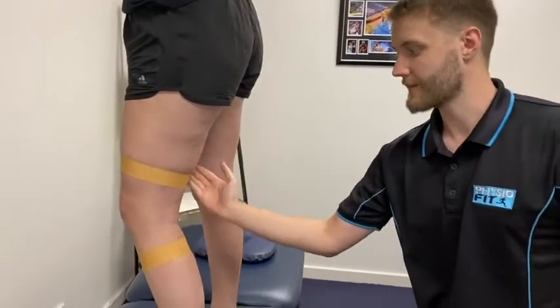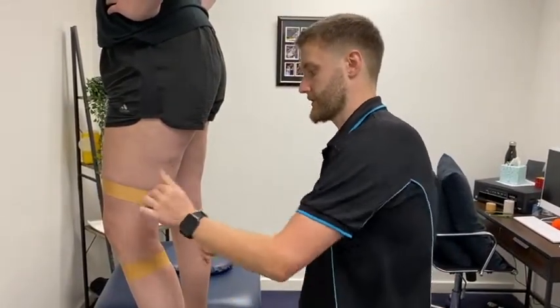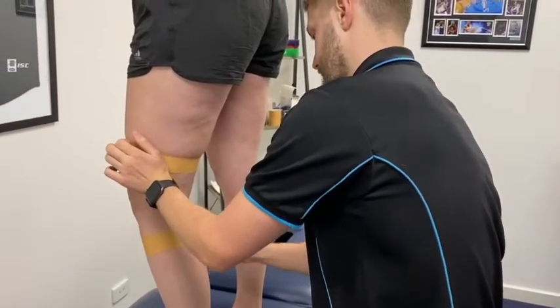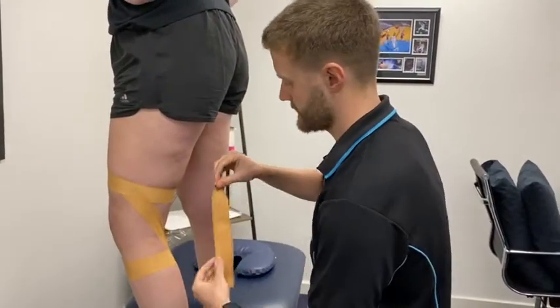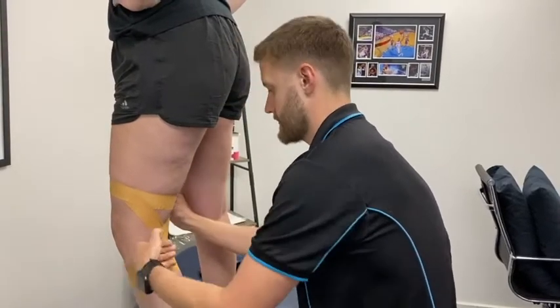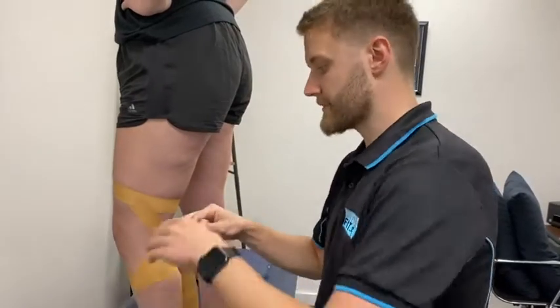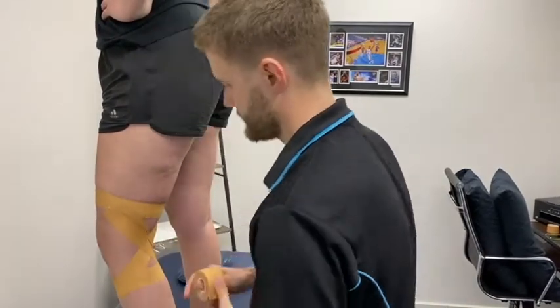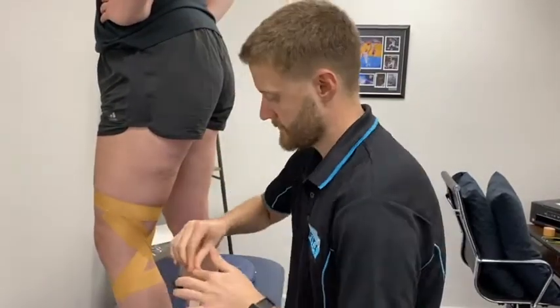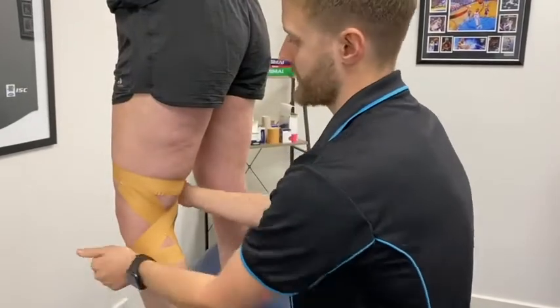The following strips we're going to do are a couple of criss-crosses behind the knee to provide a bit of support as they come into that extension position. We can use this little trick where we do the back of the tape to measure the length we might need, and then go from one side of the knee down onto the other side, repeating that two times each way. These don't need a massive amount of tension, just a little bit. We overlap the tape as we cross over so they're not following the exact same path.